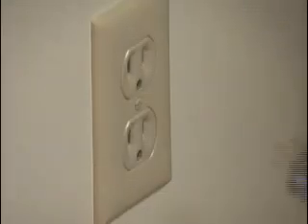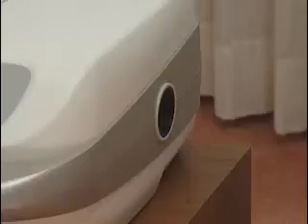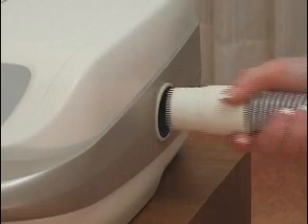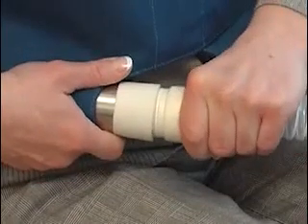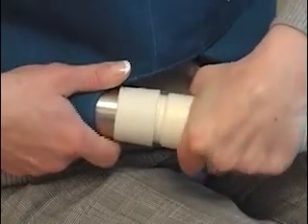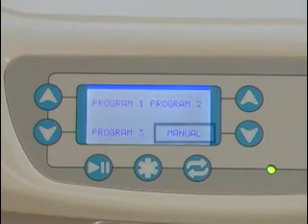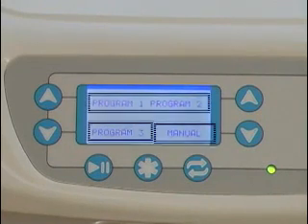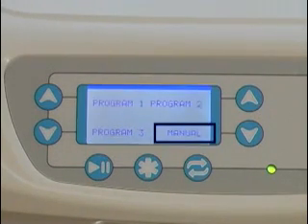Plug your SmartVest system into a grounded, three-prong outlet. The system will automatically turn on. Connect one end of the hose to the generator and twist slightly to tighten the connection. Attach the other end of the hose to the air inlet on the lower edge of your vest and twist slightly to tighten. On your display, you will see that you can use one of two modes to set the length of time and pulse frequency of your prescribed protocol: Manual Mode and Program Mode, which can save up to three individual protocols. Let's use Manual Mode first.